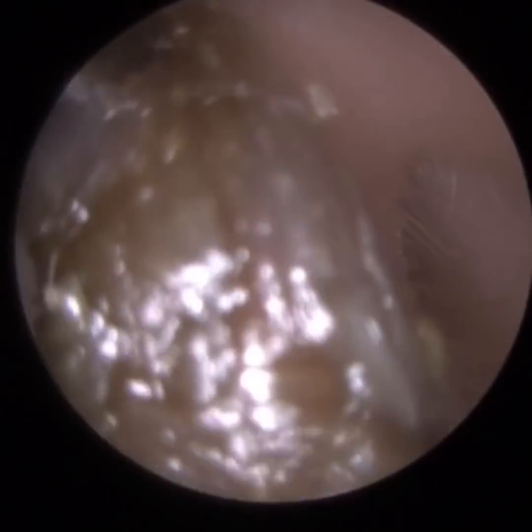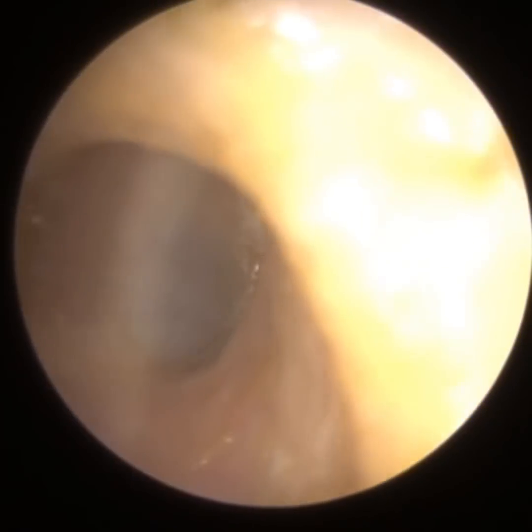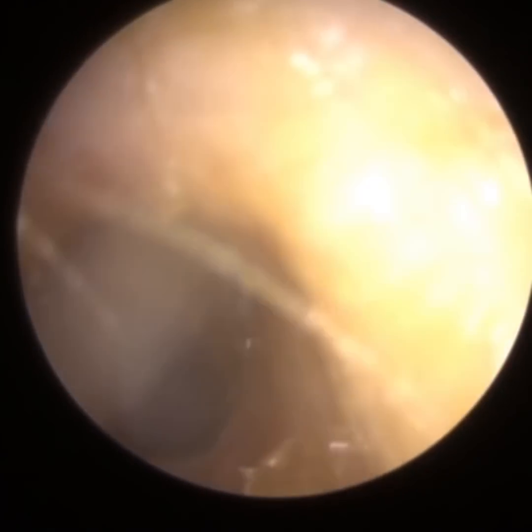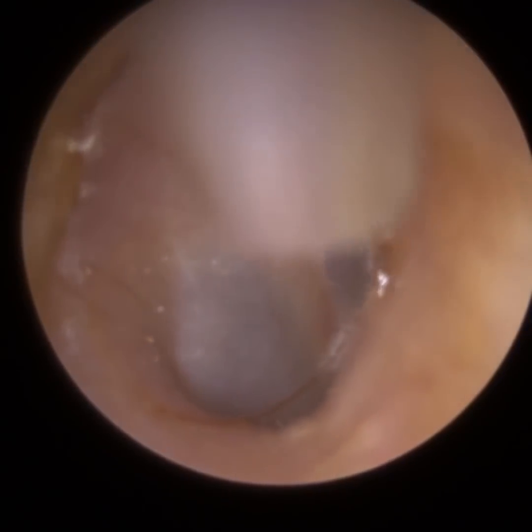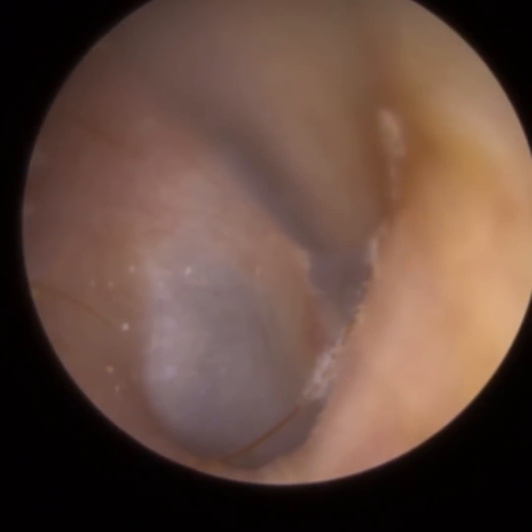So this is the patient's right ear. Again, the ear canal's completely shut at the entrance. We're just stretching the ear wide open. And you can see in that case, I managed to remove that plug of wax in one go. Now you can see on the anterior, the right-hand side of the ear canal, the front part. So the anterior means the front part. In the case of the right ear, the front part of the ear canal, facing the front of the face, is on the right-hand side. On the left ear, the anterior canal wall, the front part, would be the left-hand side.